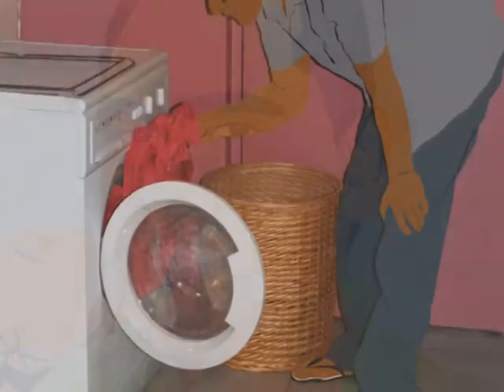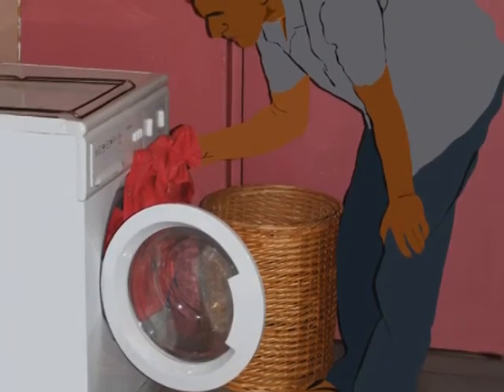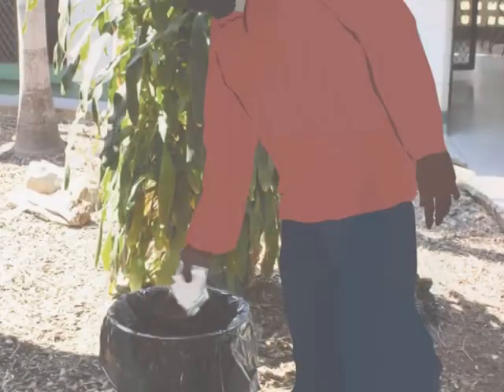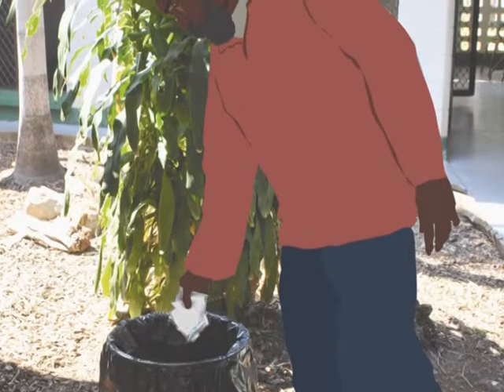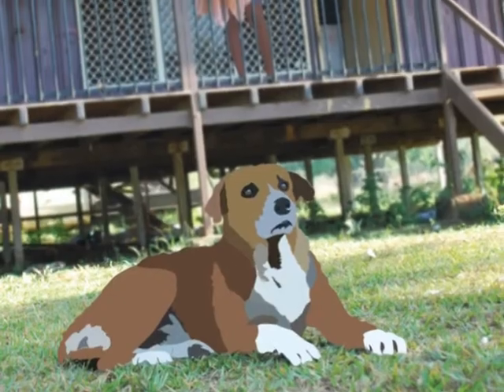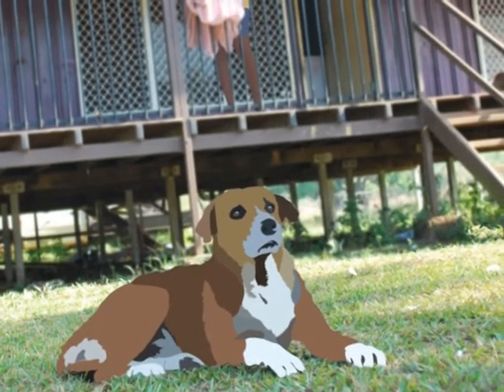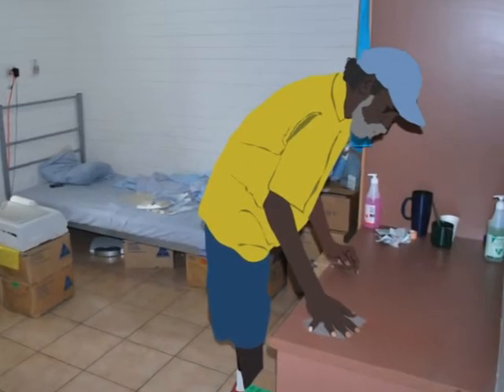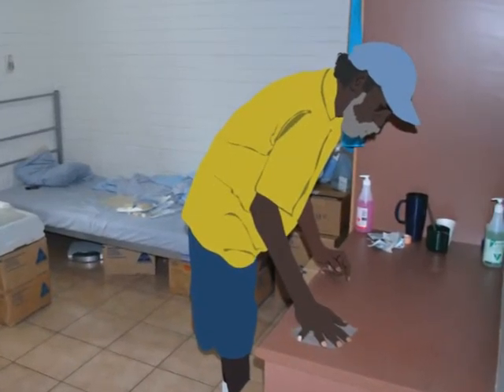To be safe, you have to keep everything clean. Your body, your hands, your teeth, your clothes, your house. Keep your dogs and cats outside because they can bring in germs. You have to keep the place where you do PD very clean.